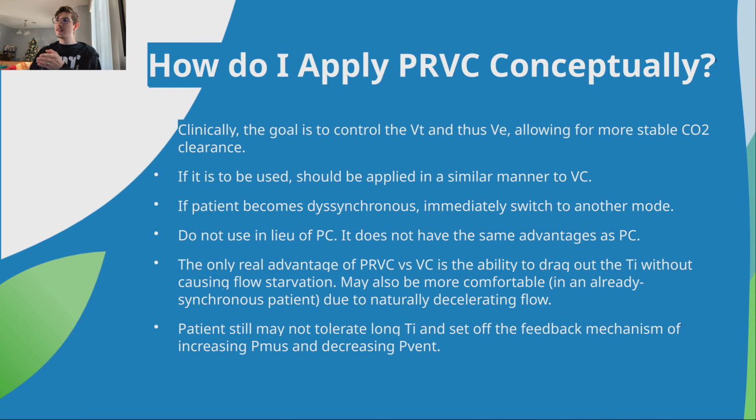The reason why I talk so much about whether it is a volume control mode or a pressure control mode is that people will tell you, oh, it's not a dual control mode. That's wrong. It's technically a pressure control mode. And I got into a debate with a guy about this actually because he said the same thing. Well, according to the equation of motion and the taxonomy of ventilator modes, it's a pressure controlled mode. And I'm like, yes, from a technical standpoint, it's giving pressure controlled breaths. Sure, you're not wrong, but you're really not controlling the pressure.